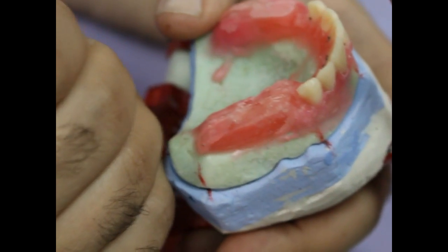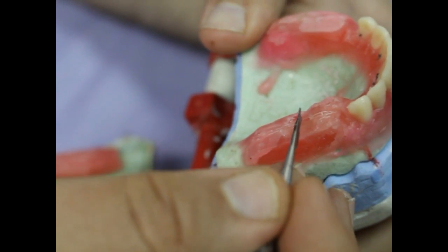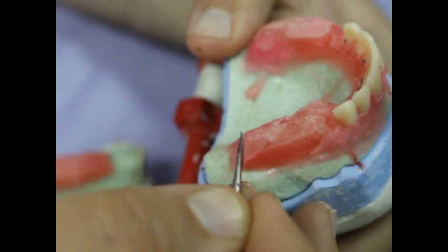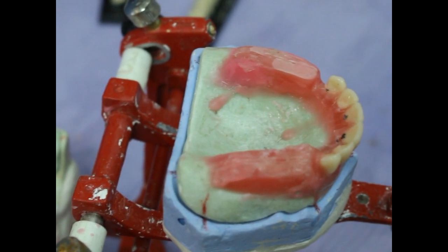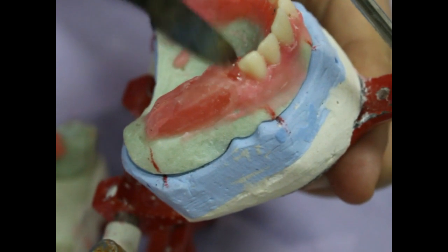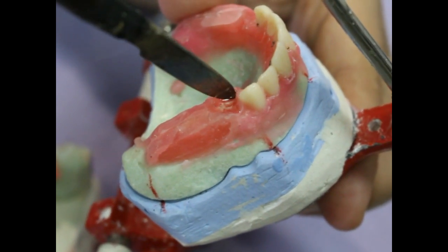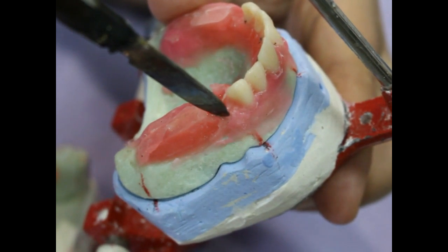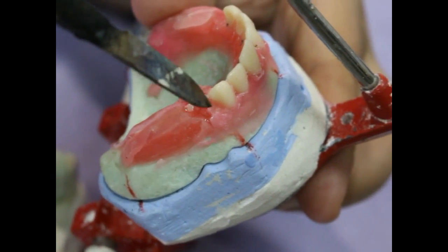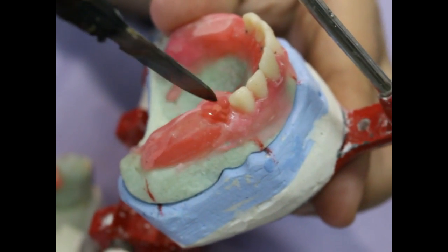We will start now setting up posterior artificial teeth. We will begin with upper first premolar, followed by second premolar, first molar and second molar. As we did with the anterior teeth, we removed some of the wax block at the required area. We softened the wax thoroughly. Take your time for softening the wax in order to ensure proper seating of the artificial tooth and proper attachment to the wax.